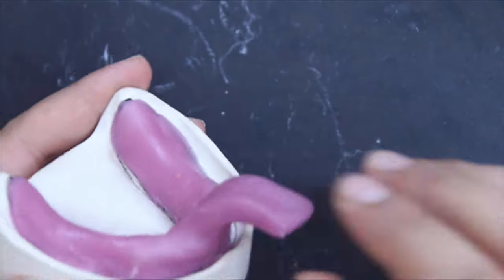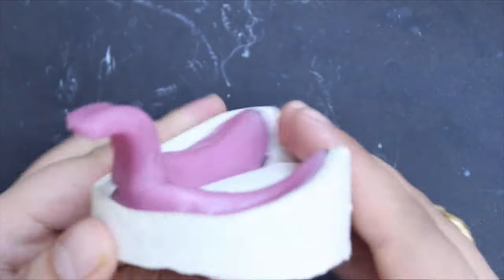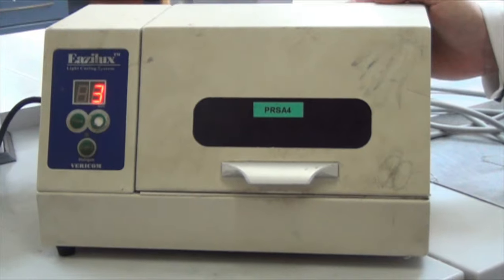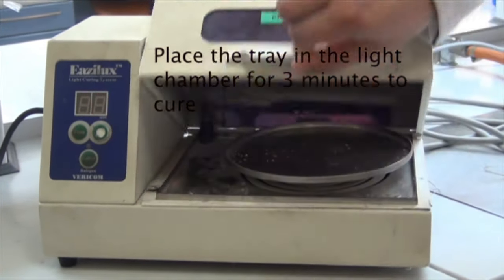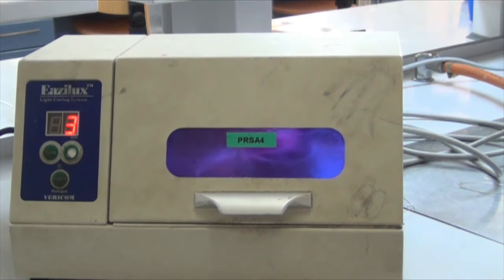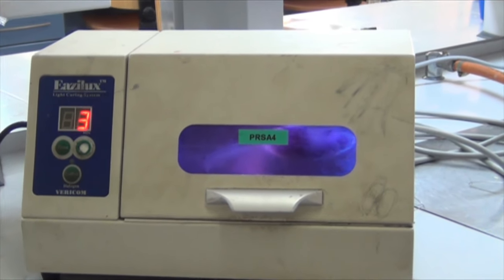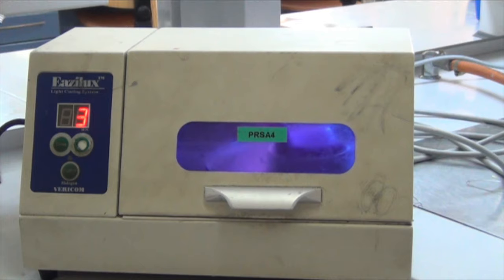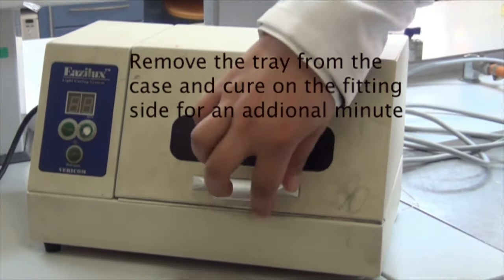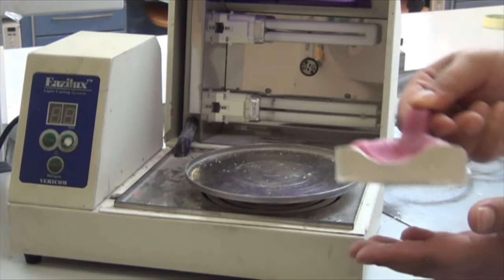Shape the tray handle the same way you did with the upper special tray. Then place the tray in the light chamber for 3 minutes to cure. Remove the tray from the cast and cure it on the fitting surface for an additional minute.